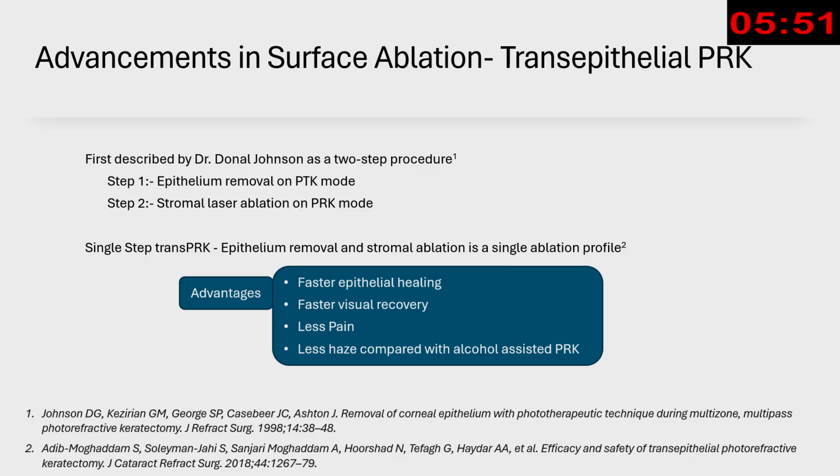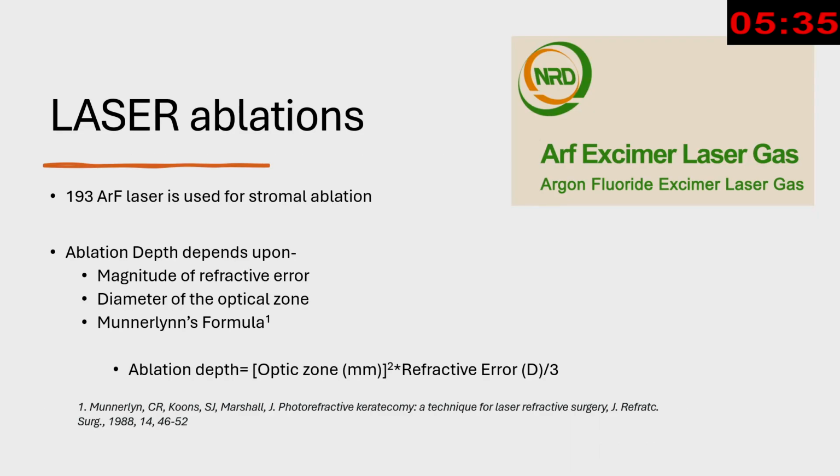Whereas now, the single-step trans-PRK mode is also more popular, where epithelial removal and stromal ablation is done in a single ablation profile. The advantages of this transepithelial PRK are faster epithelial healing, faster visual recovery, less pain, and less haze compared to alcohol-assisted conventional PRK.